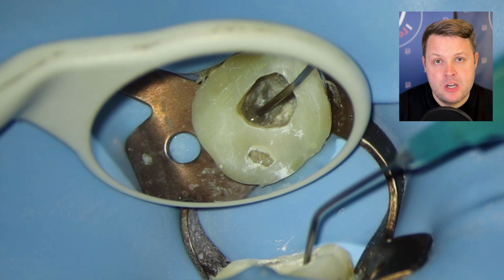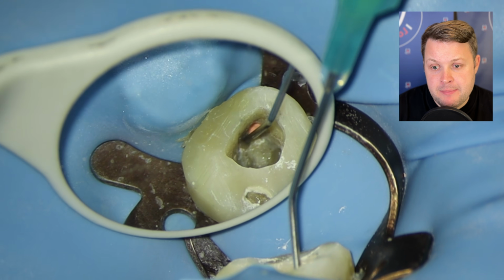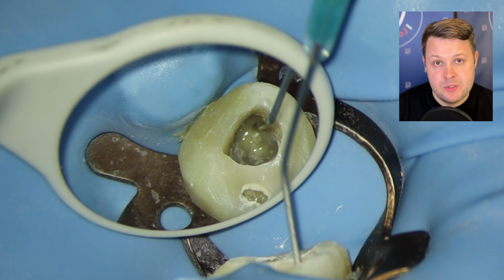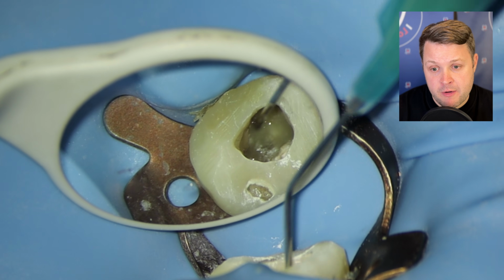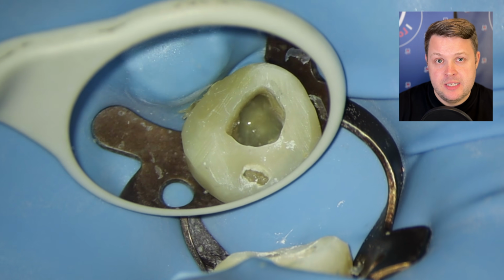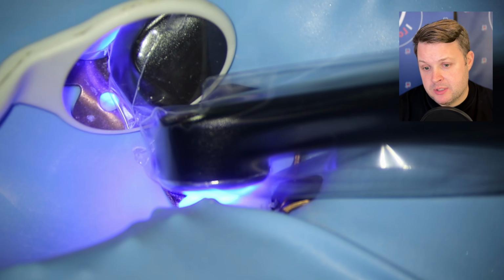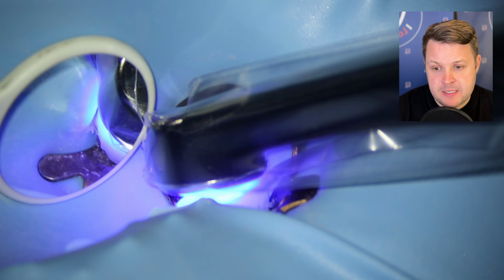I'm not going to place a composite core in this tooth straight away, mainly because I'd never get the temporary crown off. So in this instance, I'm going to seal off the GP cones and the orifices with a light cure GIC. Then once that's all sealed off, whatever you do with the coronal restoration, when you pull this temporary off, you're not going to reintroduce bacteria into the canal spaces.